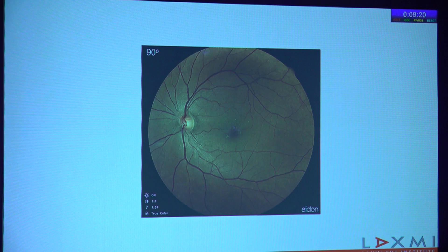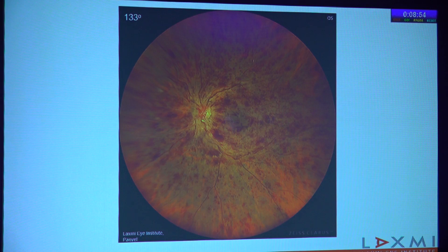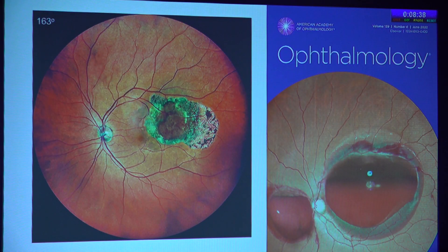Here are images of different machines available in the market today. The Eidon machine has a 90-degree field of view, so technically it does not qualify for ultra-wide field, but probably wide field. If you montage the images, you can get up to 133 degrees. The Zeiss Clarus 500 and 700 provide 133 degrees in a single image, and stitching two images together gives up to 200 degrees. The Mirante by NIDEC, which Dr. Prashant Bhavankoye has, offers a beautiful 163-degree field of view in one image.